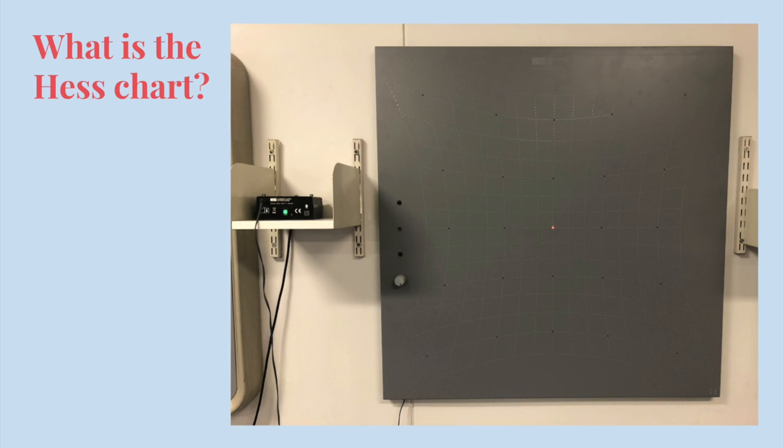This image shows a newer version of the Hess chart, where the chart itself includes red LED lights, which the examiner is able to control by using a remote. Older charts, however, require the examiner to use a red handheld torch similar to the green torch that is held by the patient. The Hess chart can be used to measure the eye movements in 15 degrees and, where appropriate, in 30 degrees.